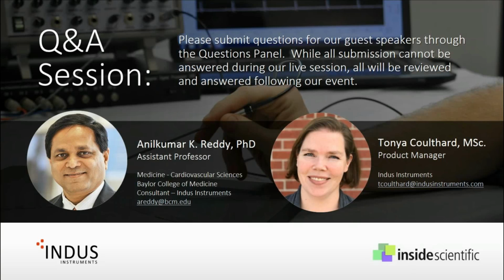One of the things we will be doing very soon, in the next several months, is to change the range on the 10 megahertz probe where we can really double it to 20, because it is capable of going to at least 22 millimeters of depth. So we're going to double that. That way it can be used from the xiphoid if necessary for rats as well. So that should tell you that you can use it on rats. And if you have smaller sized rodents, you can use these probes on those as well.